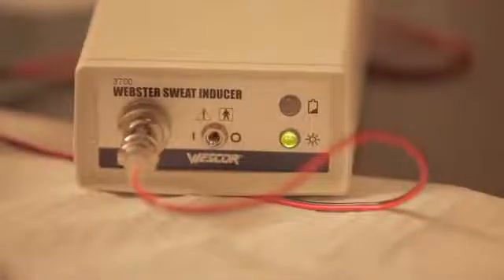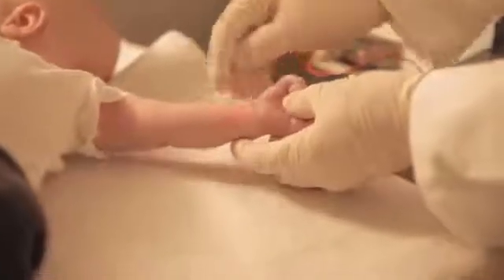The inducer proceeds automatically for approximately five minutes. At completion, an audible tone sounds briefly and the instrument turns itself off. After the inducer turns off, remove both electrodes, making careful note of the exact red electrode position on the limb. There is normally a distinct redness under both electrodes. Clean the stimulated skin and surrounding area thoroughly with deionized water and blot dry.